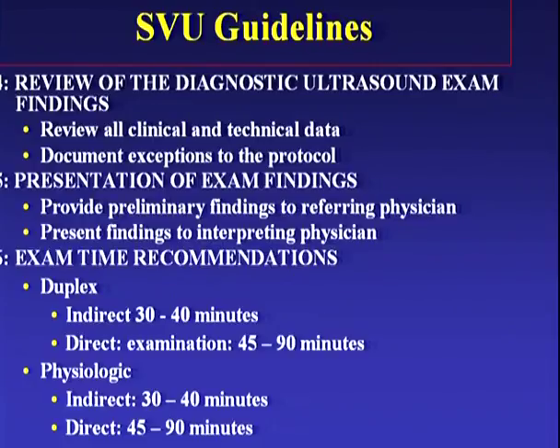The exam time recommendations for this: the duplex, the indirect portion, which is really bringing the patient into the examination and setting up the system, should take about 30 to 40 minutes. Scanning the patient itself will take much longer, between 45 and 90 minutes.